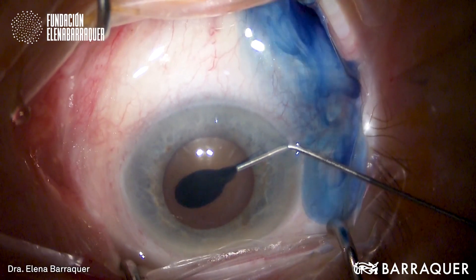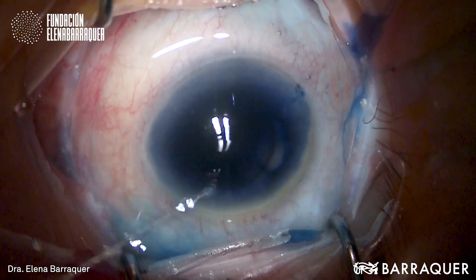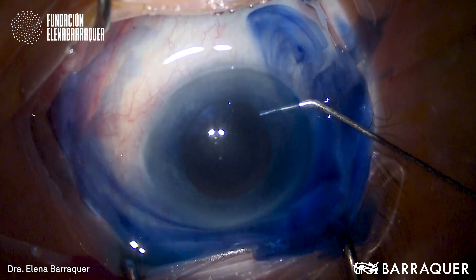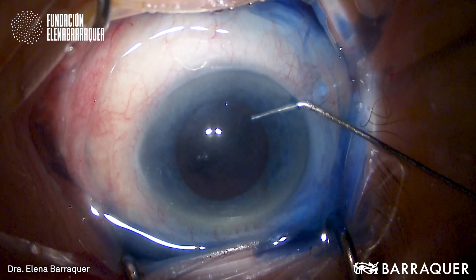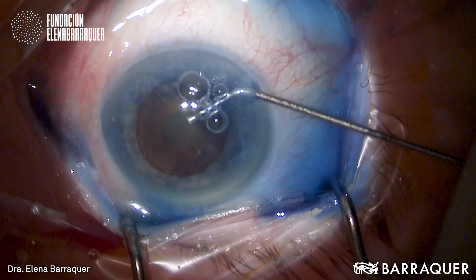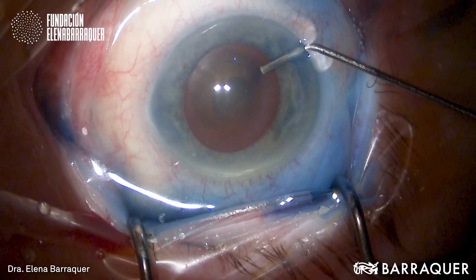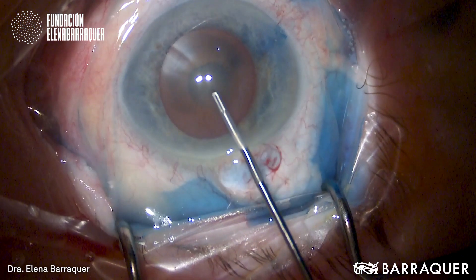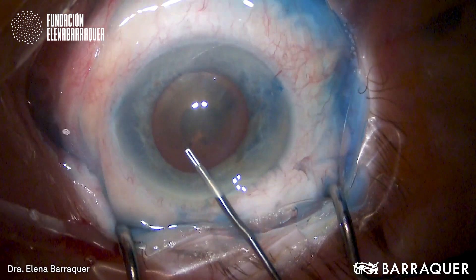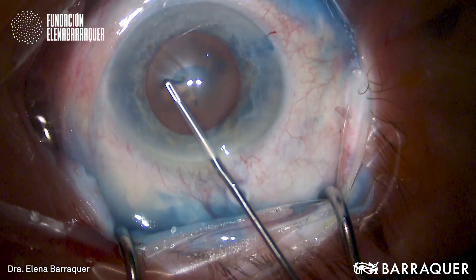This third case shows an advanced but not mature cataract. But as you can see, there was no red reflex, and with that it is easy to lose the edge of the capsule and do a less than perfect anterior capsulorexis. The patient also had pseudoexfoliation, although the pupil in this case dilated quite well.